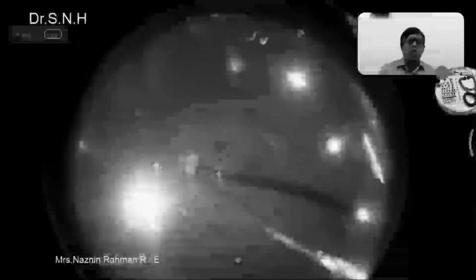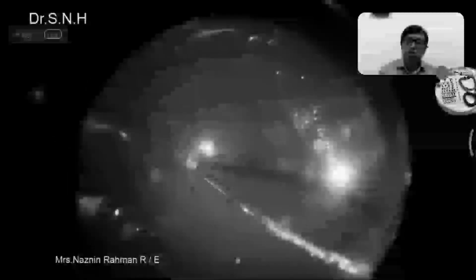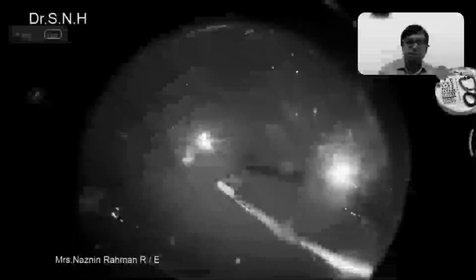Of course, you can do it using the oculars, but the three-dimensional view is excellent, particularly in macular hole surgery. It gives you comfort, it gives you safety, and the forceps, maneuvering, all these things are much better. Even the air fluid exchange, because the vision sometimes goes away when the air is there. The air fluid exchange is also excellent. The view is always there.